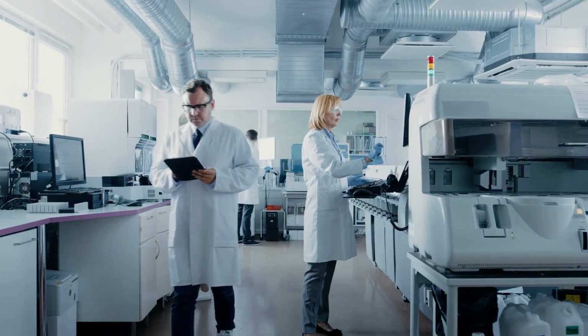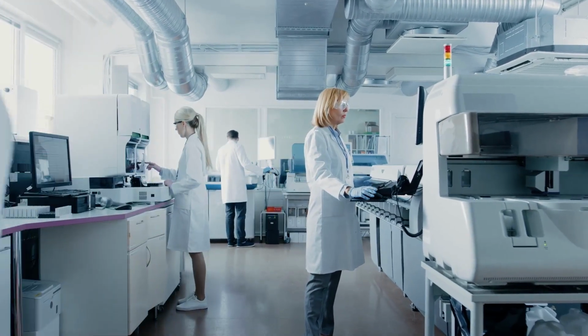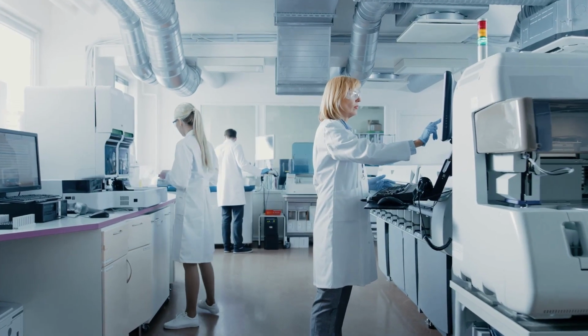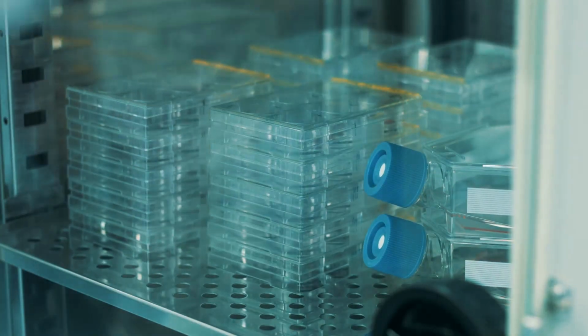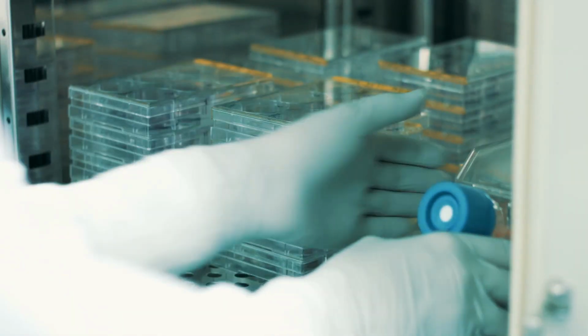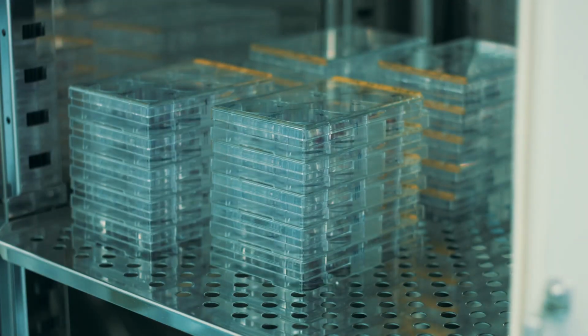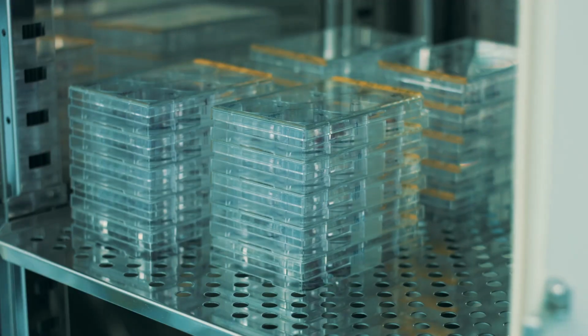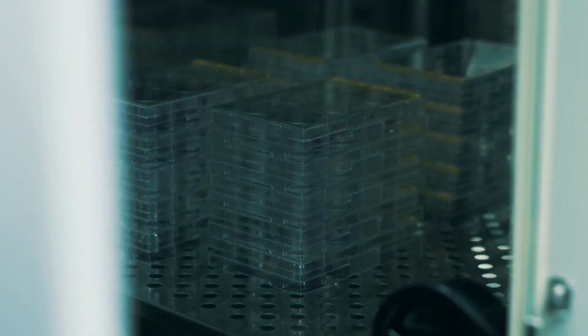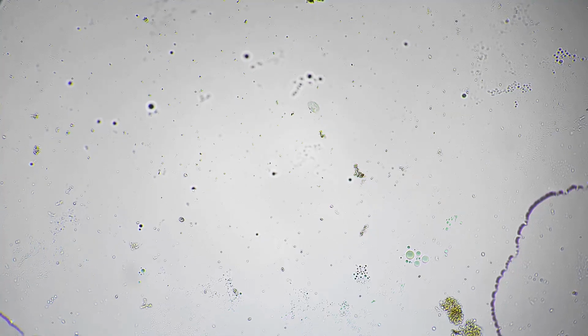First, the importance of how BIs are stored. These testy bugs need to be stored in temperate conditions, ideally in an incubator, so they can be comfortable enough not to misbehave. An incubator controls temperature and humidity, keeping the little buggers content. If BIs are stored with too little humidity, they can dry out, which can make them harder to kill during the sterilization cycle, as the time needed for the spore to open may be longer.